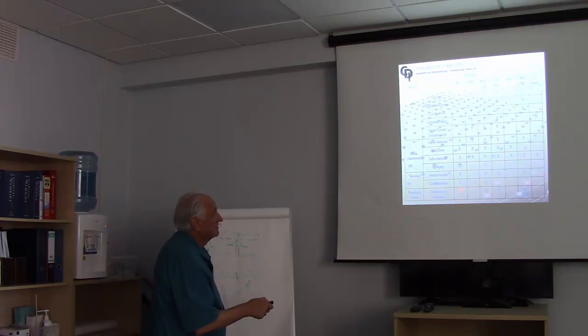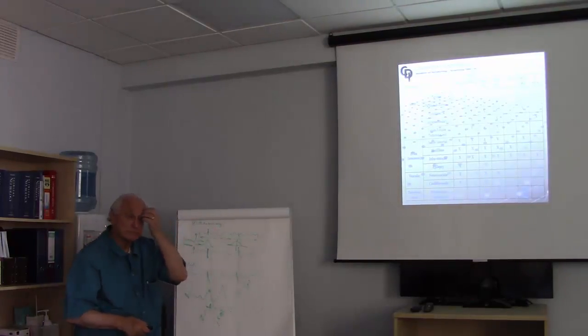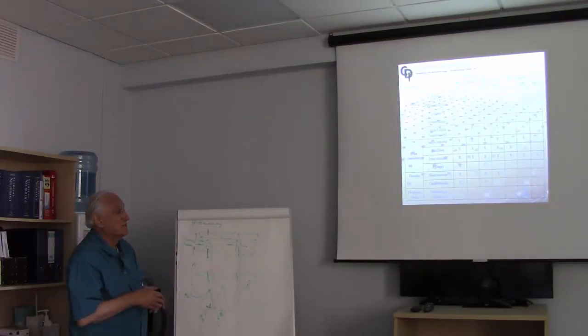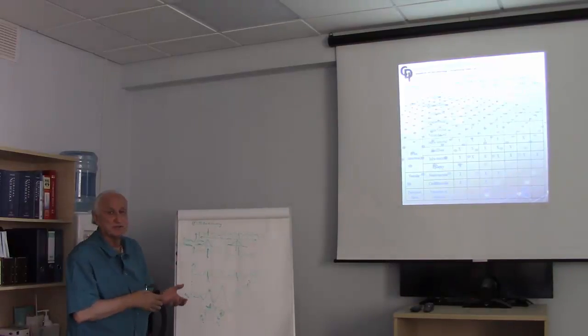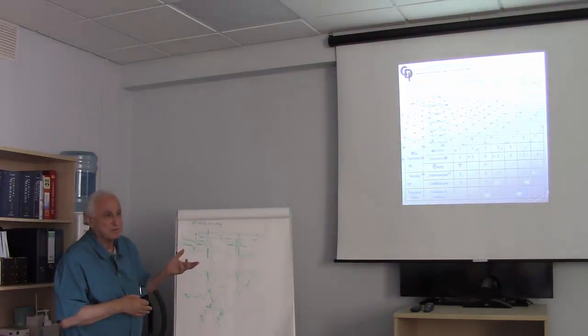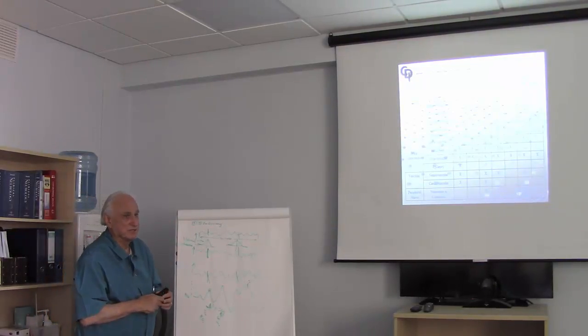Cardiovascular, same kind of idea. We usually use EEGs and upper extremity motor potentials. In peripheral nerves, we have neuromas in continuity. You may do evoked potentials, and you may do compound action potentials or compound muscle potentials. So this is kind of a roadmap of how all the tools we're going to talk about in terms of data map into the different kinds of operations. And I don't know, Brent, if you have any thoughts about other operations we ought to consider. No, I think that's fair.